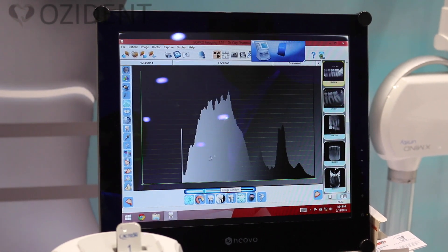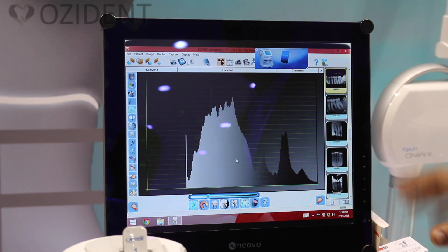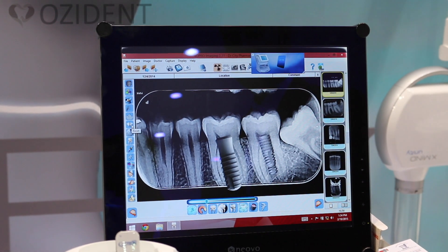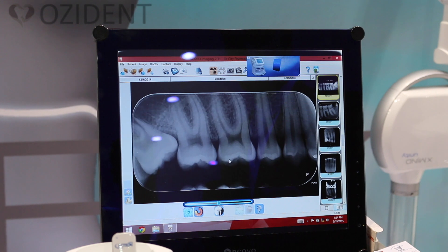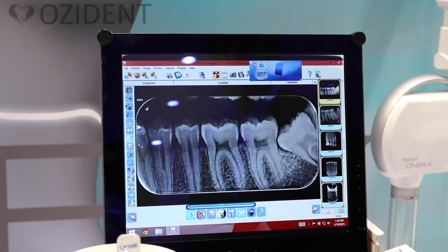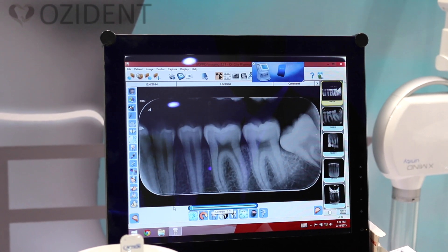Here is the histogram — it shows the exposure level for each part of the tooth. Then there is the reset option, if you want to reset the image back to the original. There is also the contrast option, where you can increase or decrease the contrast.